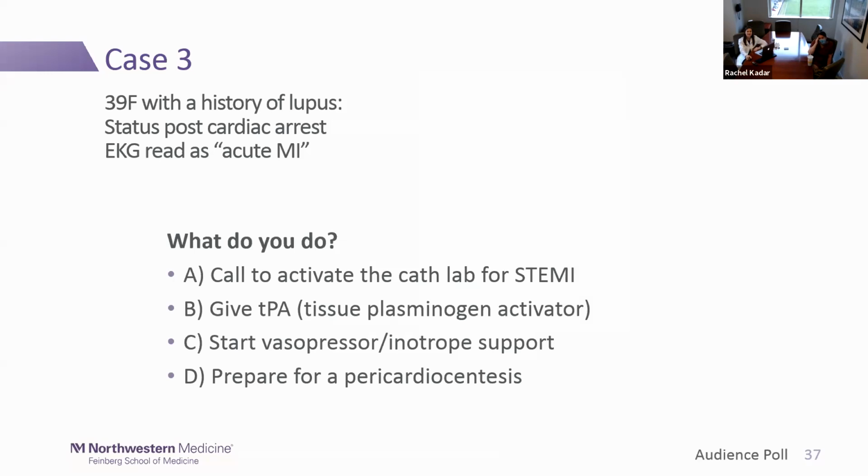Here we go. Now let's try again. Thank you for the kind people who answered anyway. All right, so we can see now that the next step would be to prepare for pericardiocentesis.